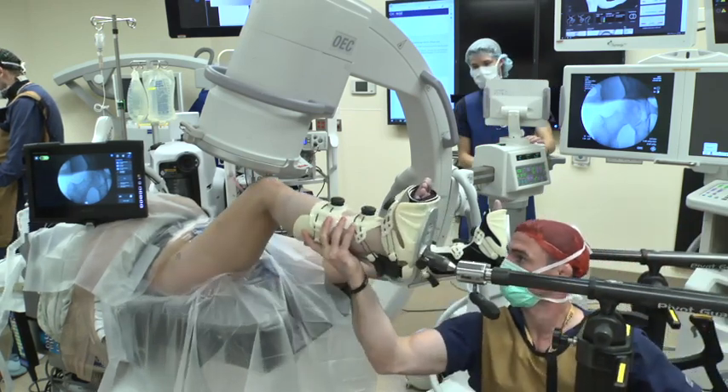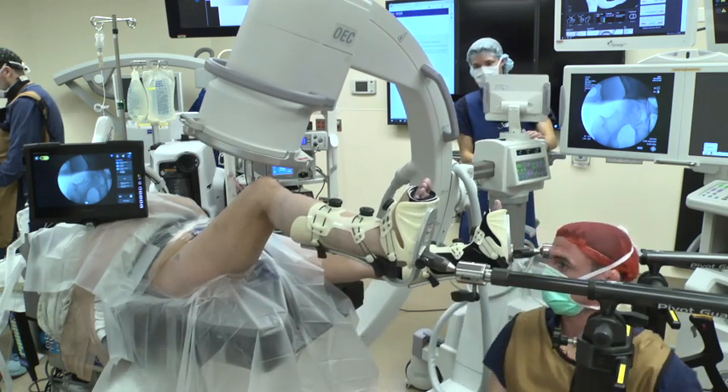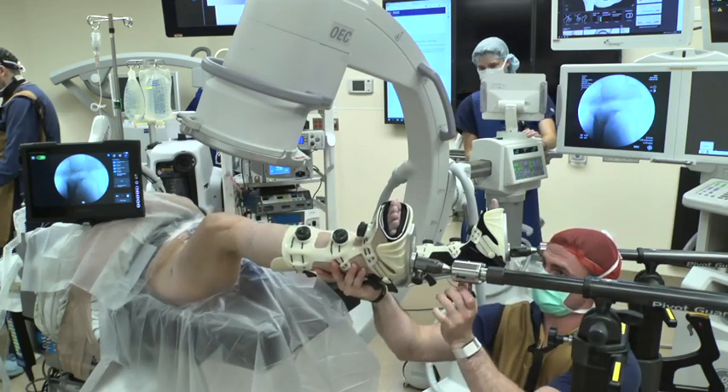The hip is then flexed to approximately 50 degrees and images are obtained in neutral rotation, 40 degrees and then 60 degrees of external rotation.